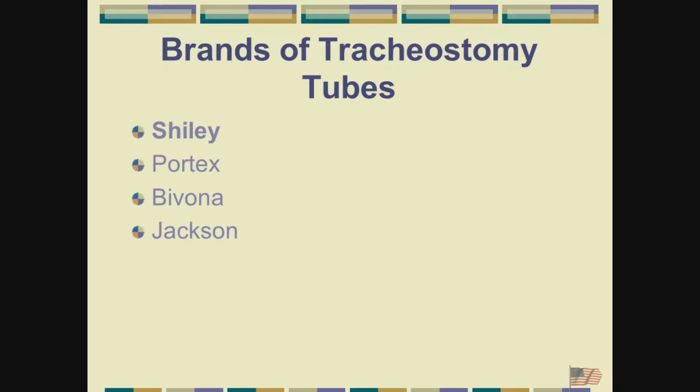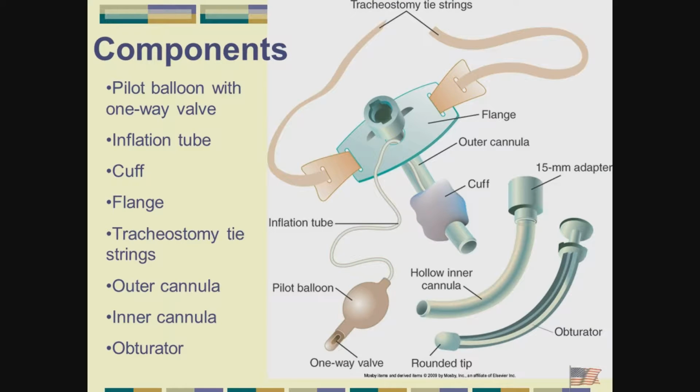That's fine. People say, "Oh, you don't use those anymore." They're still out there. They're actually a nice airway for long-term management if we just need the airway in because I need to suction the patient out. Okay, but Shiley is the one that we'll focus on the most.